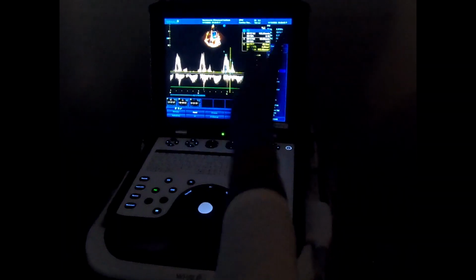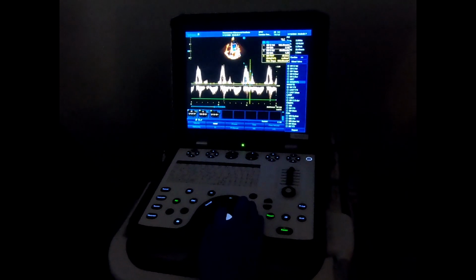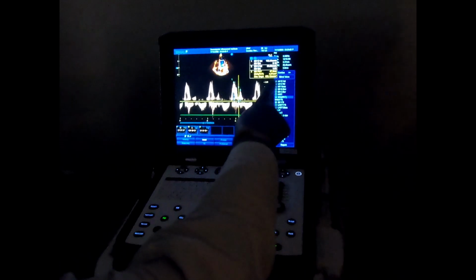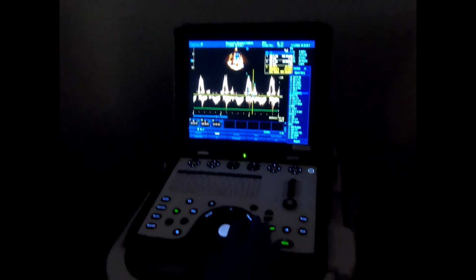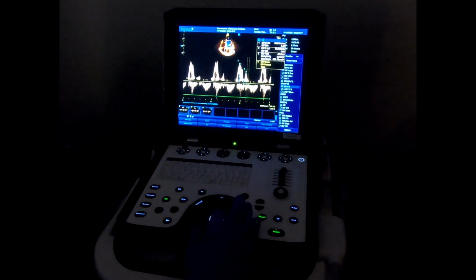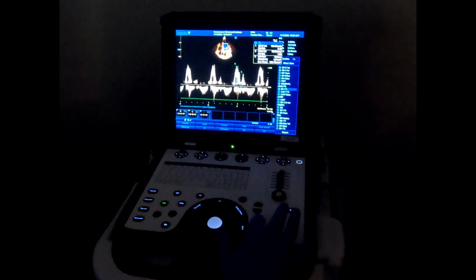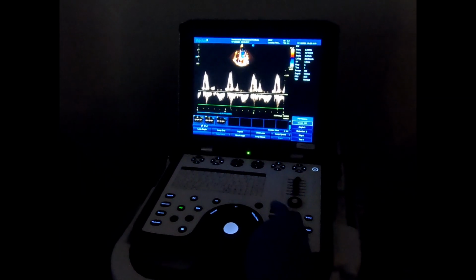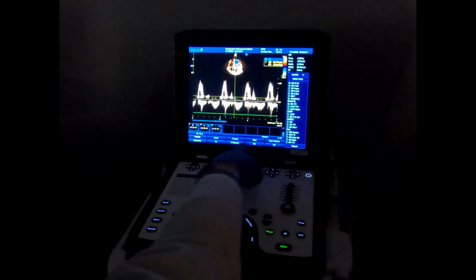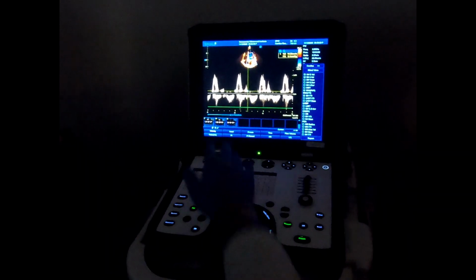So now you need to also exclude those extra bumps that you have. You need to trace or slice those. See, those are artifacts. You need to stick to the actual. And then you have A duration also with this. For the A duration, this one right there. I would suggest store this one. Okay, we already stored. And then you go again for the measurement. See, now these are active. So once you use the package, these will sometimes become inactive.